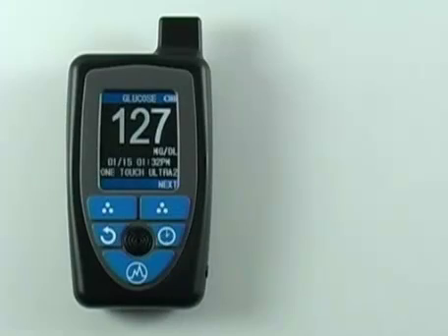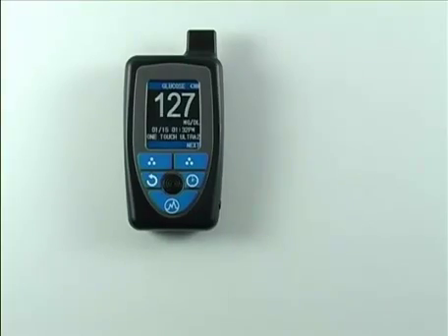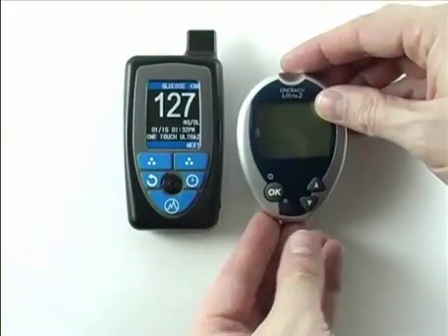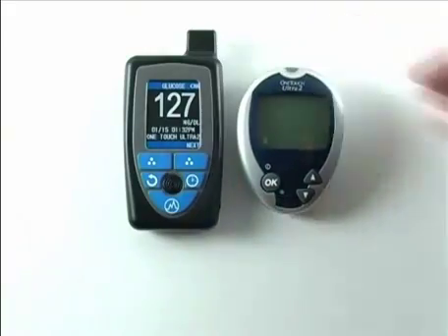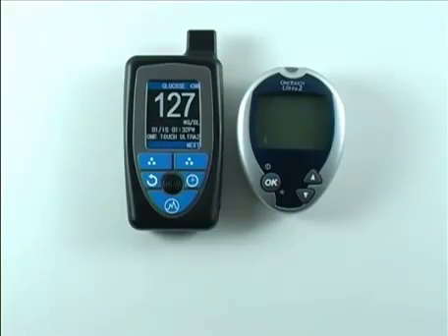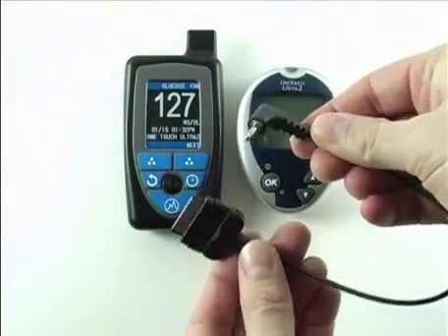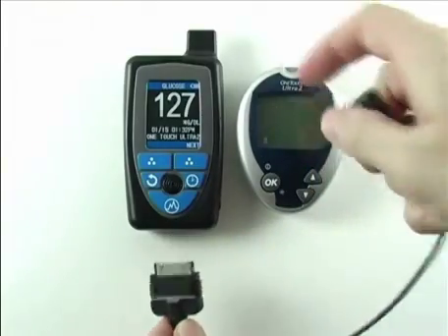We will start by showing you HealthPal using a glucose meter and briefly show you some of the functionality of the HealthCom system. For this demonstration, we will be using a LifeScan OneTouch Ultra 2. This particular glucose meter is not a Bluetooth-enabled device, so we will interface with this meter using our proprietary smart cable, which I have here.